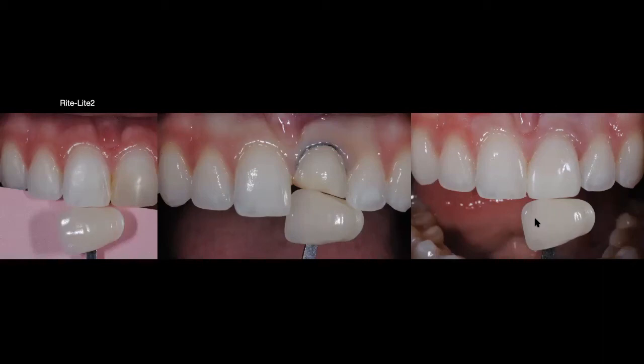All I'm looking for is a basic shade. So I just want to make sure that they're blending in. And I just want to tell the lab, this is the lightest shade tab that I'm using. This is the lightest shade tab that I have. This is the 3D Master shade tab, this 1M1. And now I'm going to take a photo of that 1M1 right next to the composite, because I want them to see the difference in value. And I want them to see how this value that I had obtained with the composite matched the tooth.